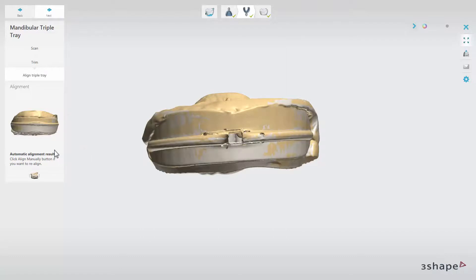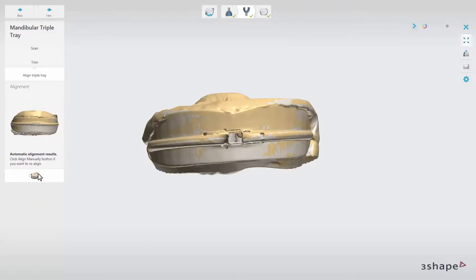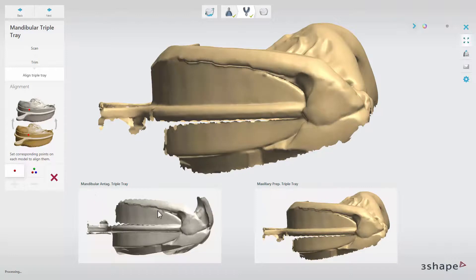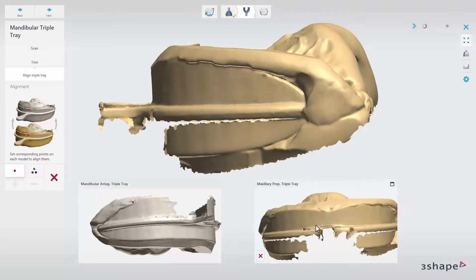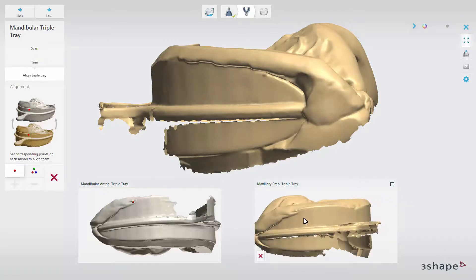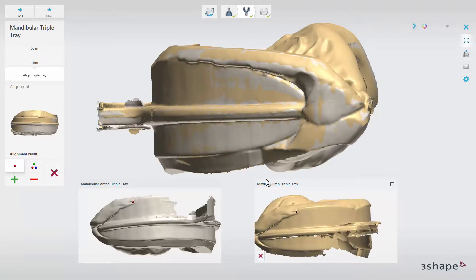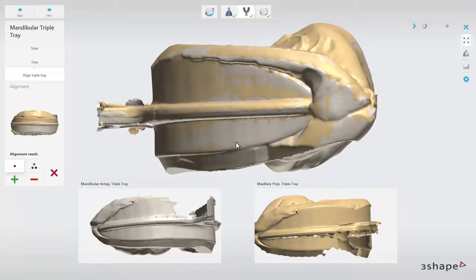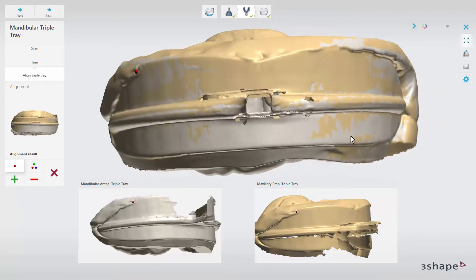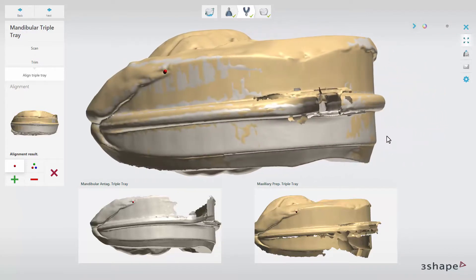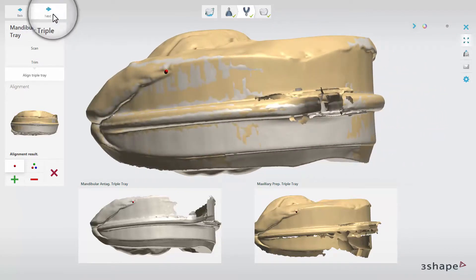Also at that stage, you have the possibility to do that manually using one or three-point alignment. In the manual alignment, one-point alignment is the default option. Place a point on the bite impression scan and then in the corresponding place on the upper jaw scan. The scans will align.